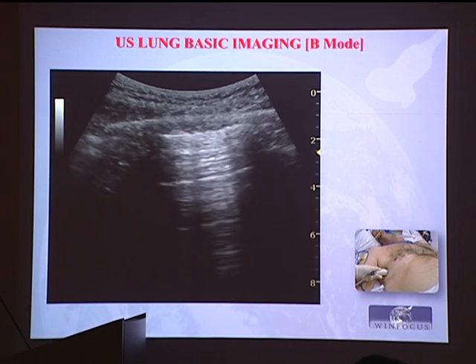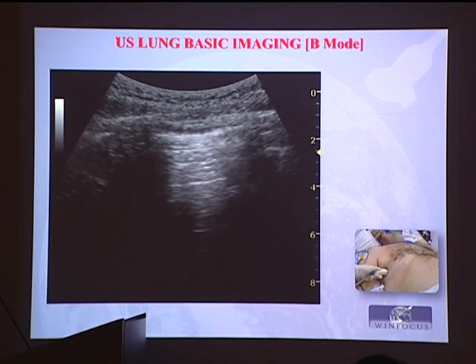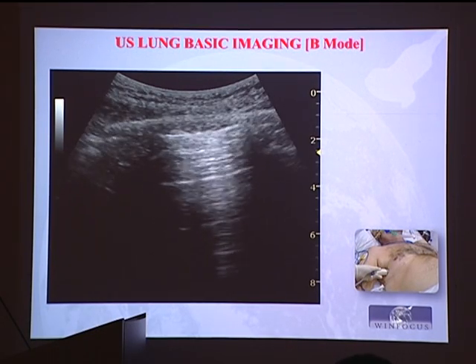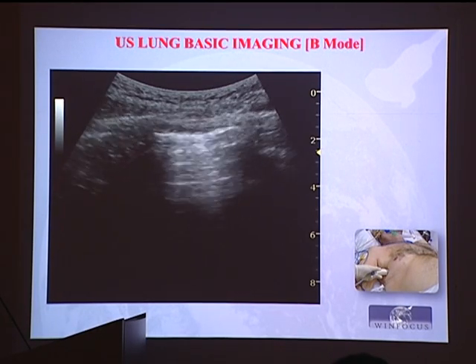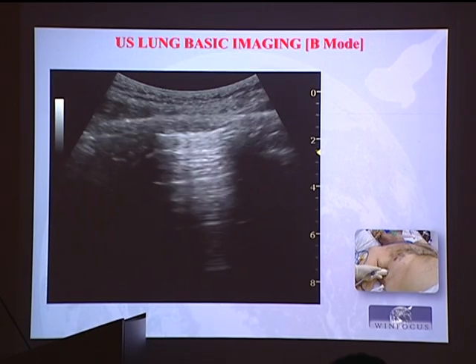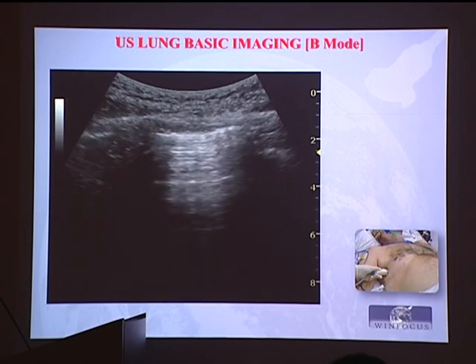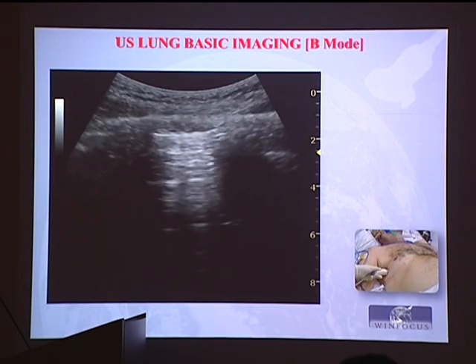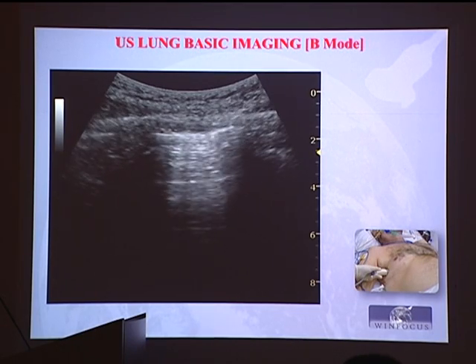And then either you redo the examination, or you stop and say ultrasound is not feasible. Or you try to interpret it, but your reviewer or your colleague or the patient or whoever is reading your report should know what were the conditions under which you have performed your interpretation. Okay? From now on, I will not insist anymore on the quality, but this is a crucial starting point.